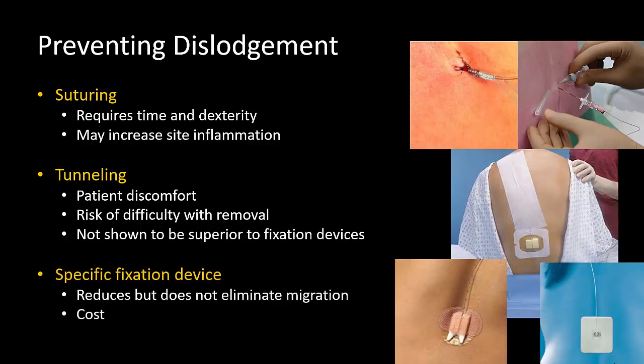Various fixation devices are available. Some are more effective than others. However, none of them will completely eliminate the problem of migration, and they will be associated with an increased cost. At the end of the day, what is probably most important is attention to detail and a well-applied dressing to clean, dry skin.